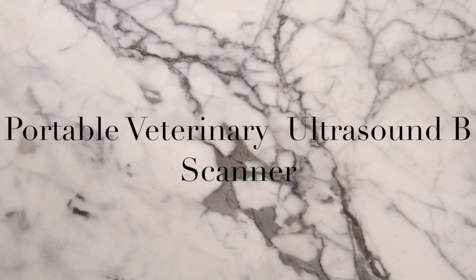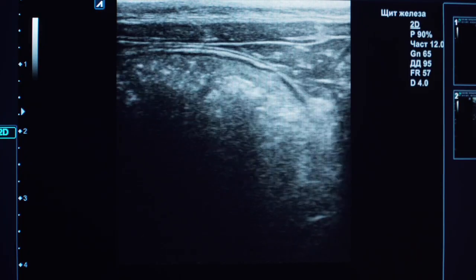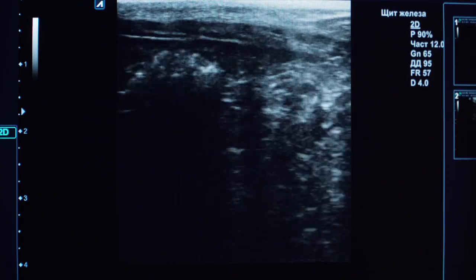Just like the name sounds, it is a very portable device which uses ultrasound technology to create real-time images of the internal structures of any farm animal. The B simply stands for brightness mode, which is the most common type of ultrasound imaging, providing a two-dimensional cross-sectional view of the tissues. I will explain this in detail shortly.